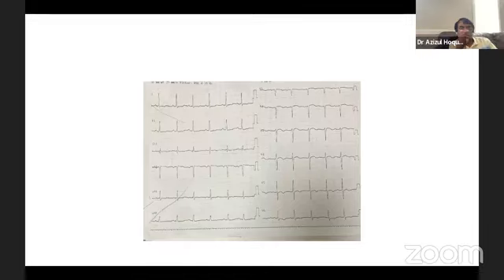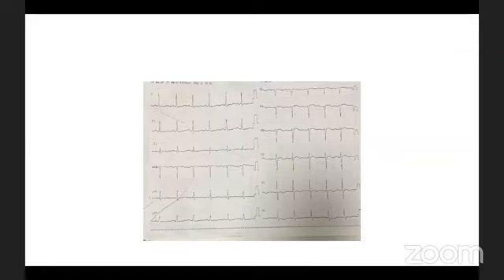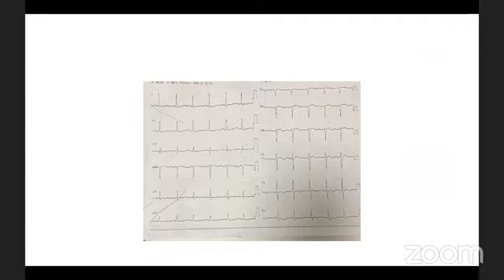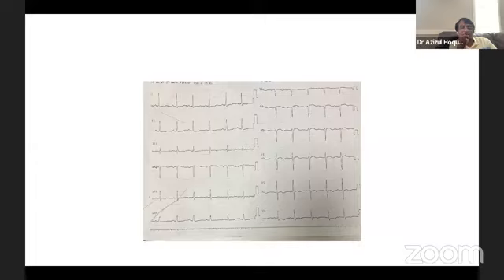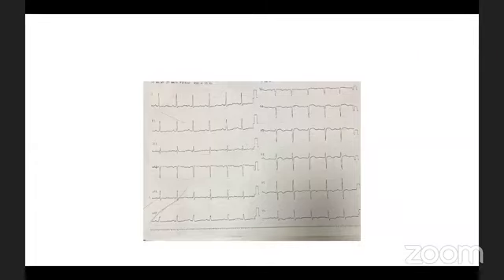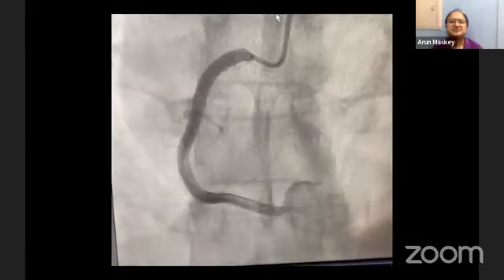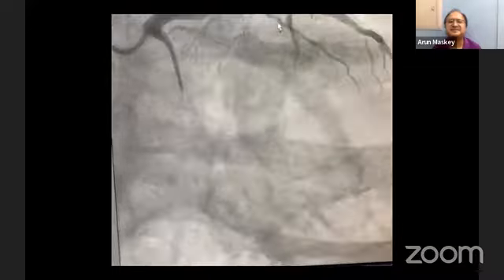I think you mentioned the fatal complications. So the faculty, we all are worried, but probably you did the cath and there is an indication to go to the cath lab, because the chest pain is classic. It is looking like LAD, most likely. Therefore we will probably go to the cath lab. One of my colleagues did. So we took him to the cath. This is a picture of the patient.